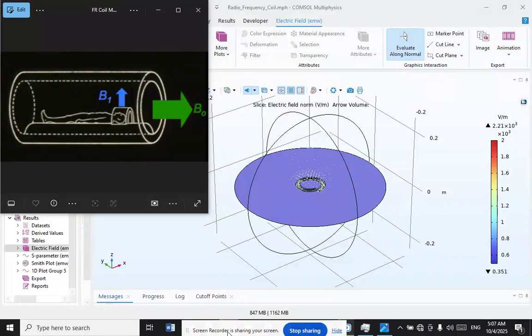Every MRI system, as you can see in this left picture, is a mix of several subsystems that each provide necessary functionality to generate an image of an object. In general, RF coils act like a broadcasting station. They transmit and receive signals.